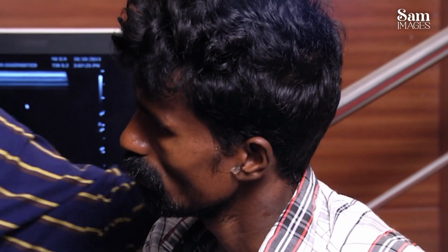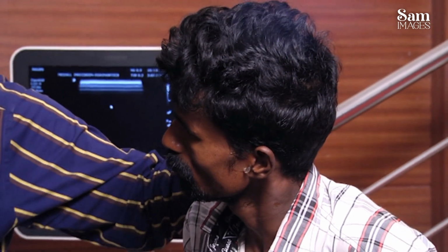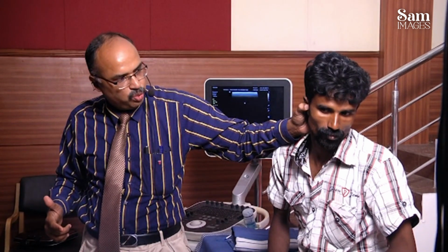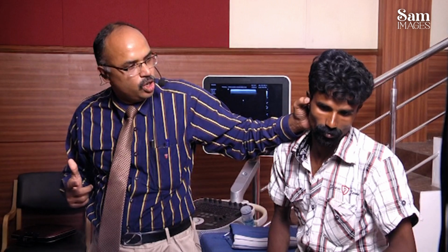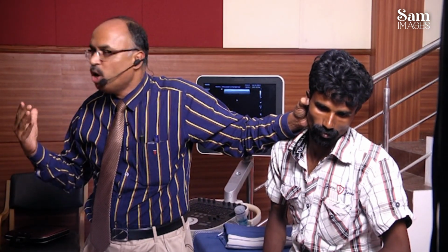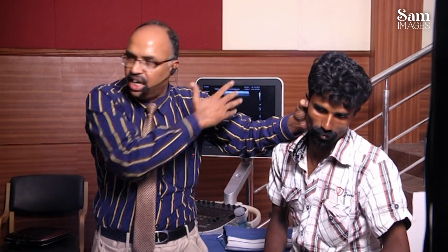After doing this, I am again keeping my thumb on the tragus of the ear. I am pulling the tragus because the joint is very close to it. So I just push the tragus of the ear more towards the ear.